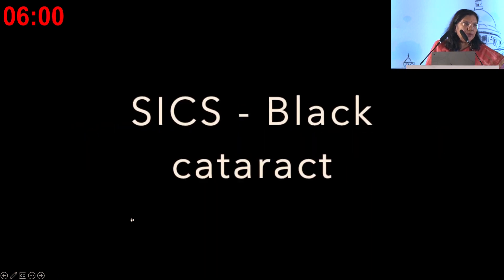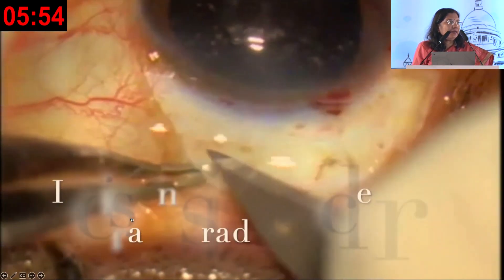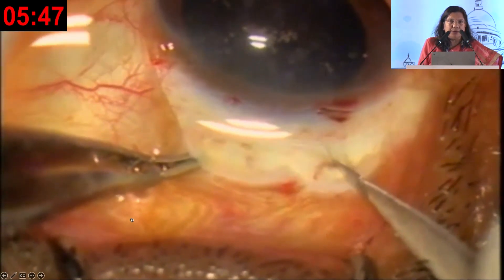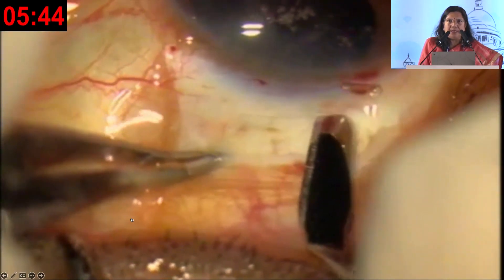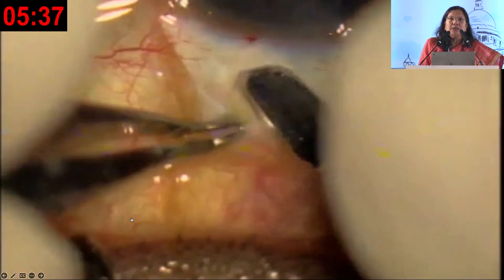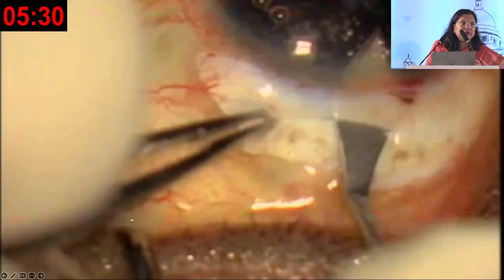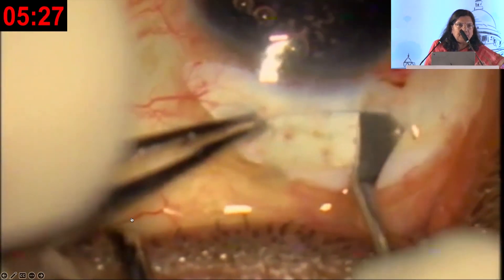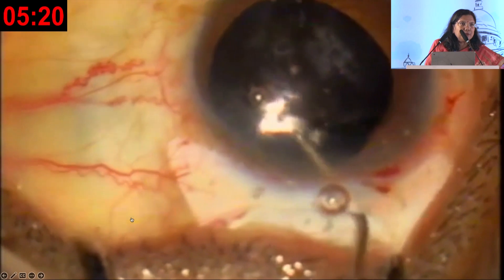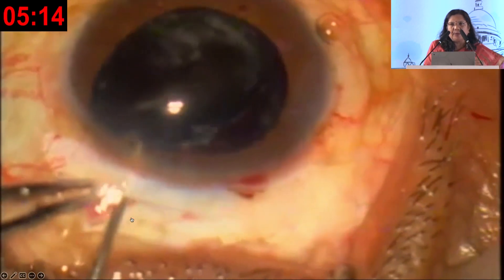This is a black cataract — cataracta nigra. Patients come with this because they are old and unwilling to come in, waiting a long time. The incision size will always be according to the grade of the nucleus. It cannot be four millimeters — that would cause iridodialysis and iris prolapse. The nucleus size is larger so the incision will be large, but most patients have not required suturing if the tunnel is done properly. The pockets are really deep in this patient because the nucleus is hard and will not mold itself.